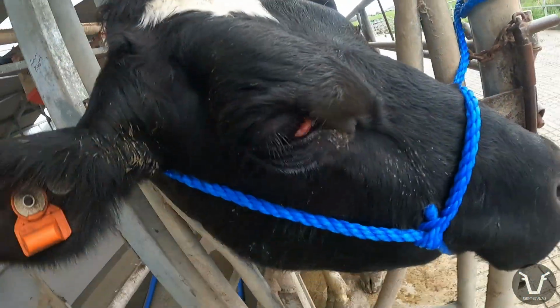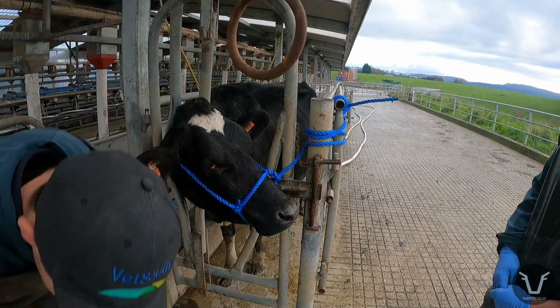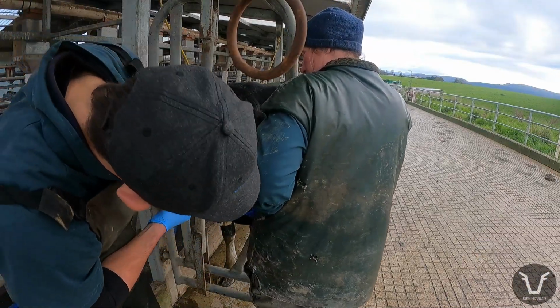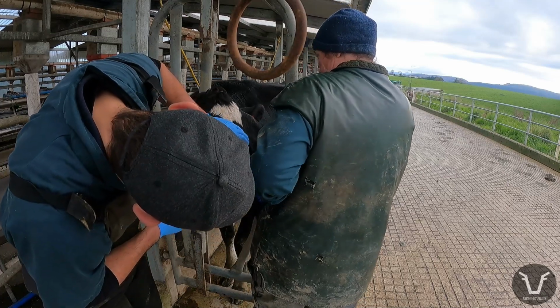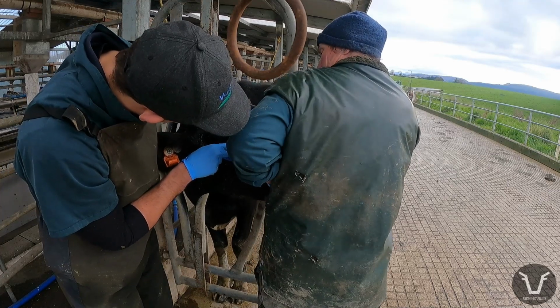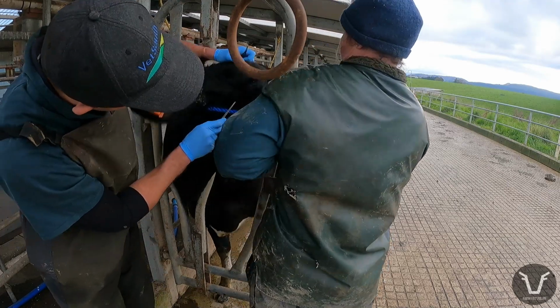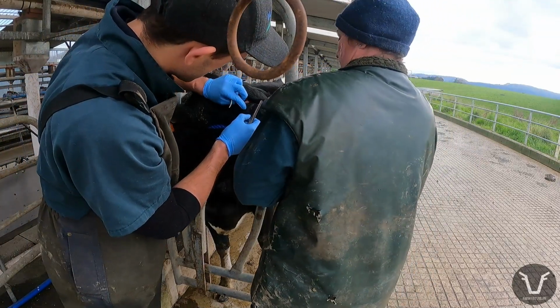The third eyelid is a triangular flap of tissue, so the plan is to grab it with my forceps, then make two cuts, one in line with the lower eyelid and one in line with the upper eyelid. I'll be trying to take as big a piece as possible, giving myself as much distance as possible from the cancer, and this should give us the best chance of not leaving any microscopic trace of the cancer in there, which would likely grow back and put us in an even worse position than before.